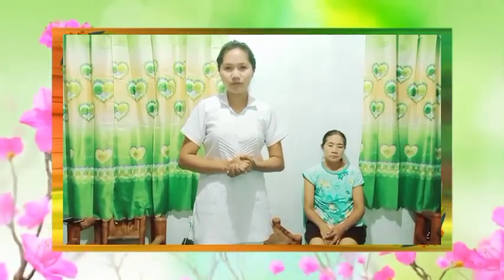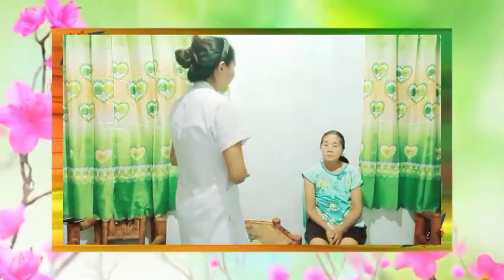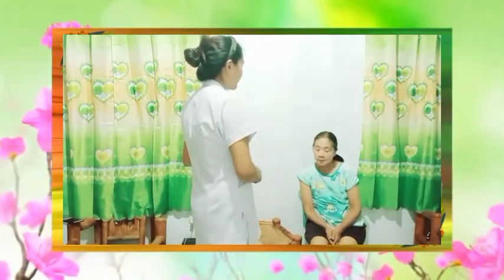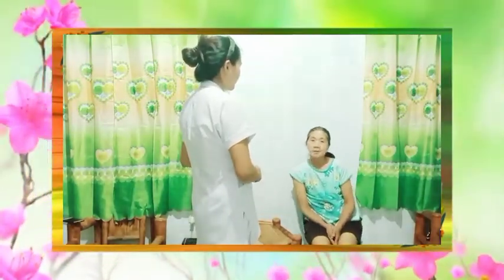The first thing we're going to do is introduce ourselves to the patient. Hi ma'am, ako po si Richelle Meiluzano, ang inyong nurse ngayon. Then the next step is to identify the patient using two identifiers. Ano pong pangalan niyo ma'am? Josie Antieta. Birthday po? January 29, 1967.